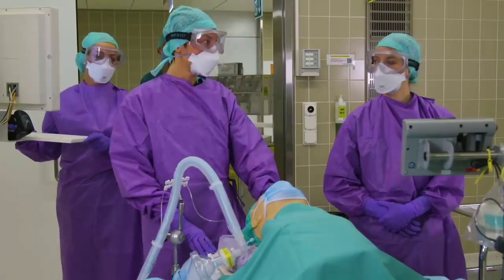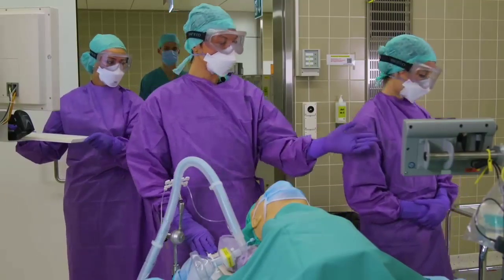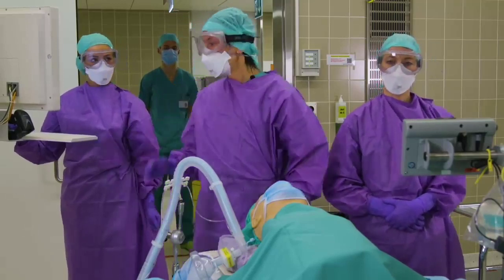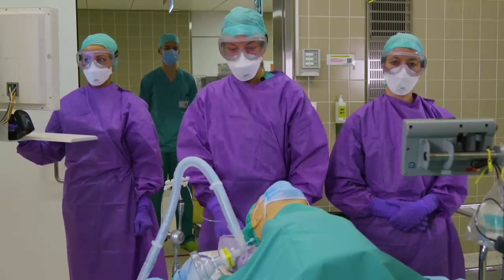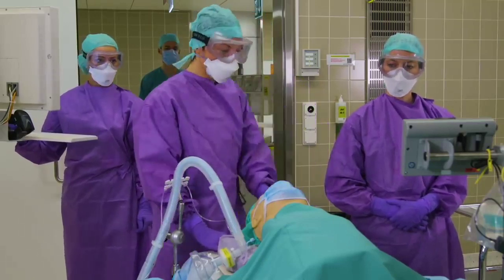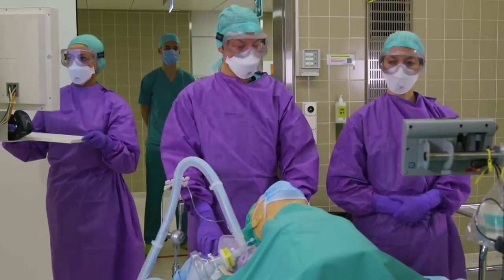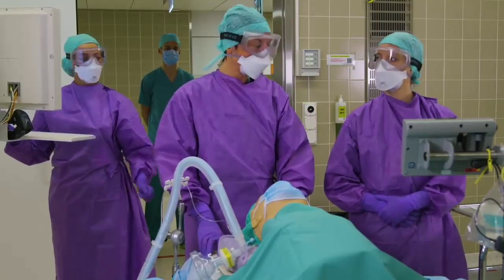We designated our roles clearly, with Larissa being the medication person and airway help, Manila doing the documentation, Tim outside as a clean person, and myself as a seasoned anesthesiologist doing the airway.